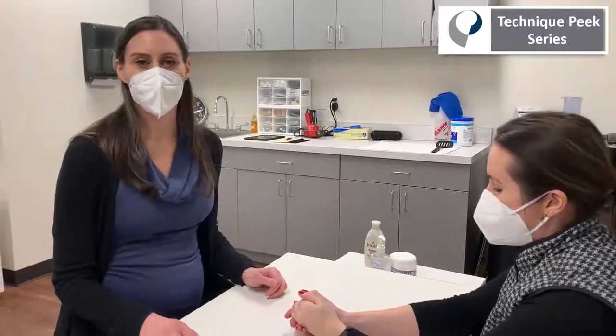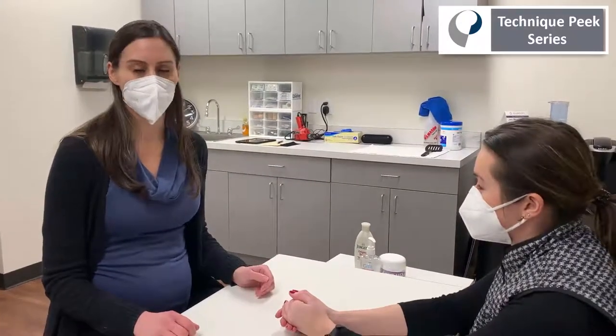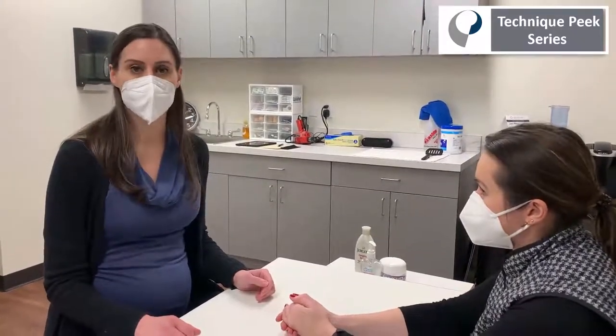Today we're going to talk about how to make a relative motion orthosis, also commonly known as a yoke orthosis. Sometimes you'll see these used with extensor tendon injuries and sagittal band injuries.